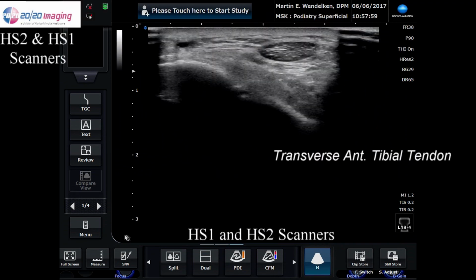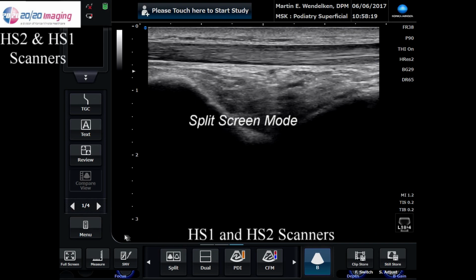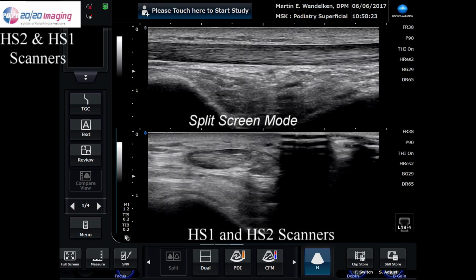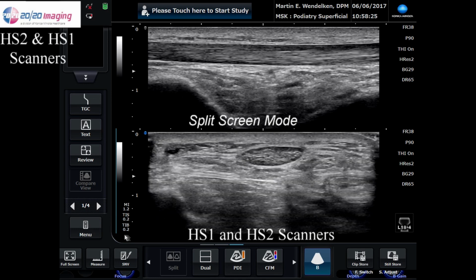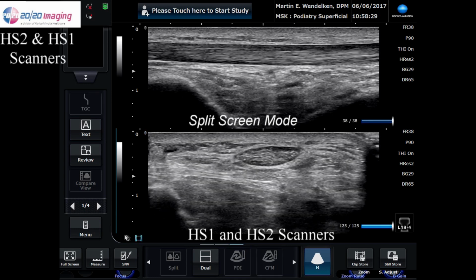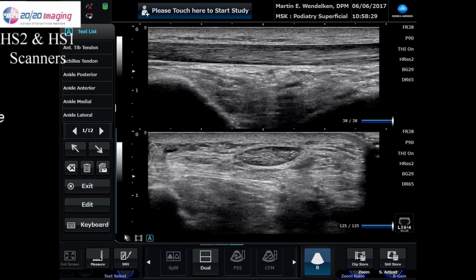So one of the nice things you can do is actually split the screen so you can see the tendon in both the longitudinal and the transverse plane. The HS2 actually has a beautiful image in that it gives you a very long image of the tendon in the long axis, and at the same time you can clearly see it in the transverse axis.